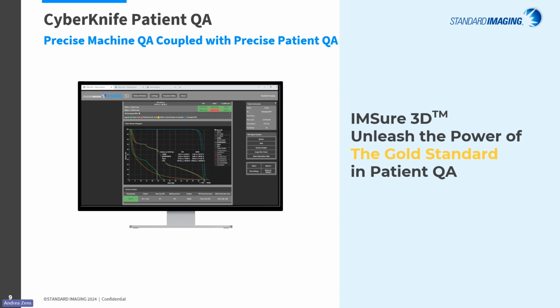As you are all well aware of TG219's recommendation, its minimal requirement is a secondary 1D dose MU calculation, sort of independent check, be done for all RT plans. However, this may be unreliable as plan complexity increases with small fields and high gradients, exactly the types of treatments that CyberKnife is particularly good at delivering.